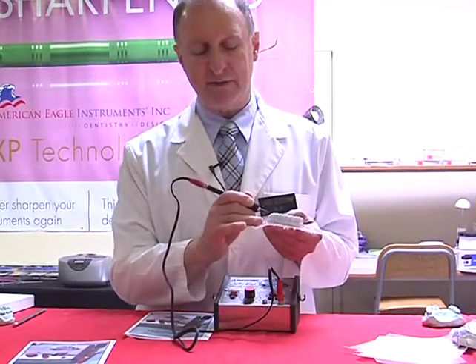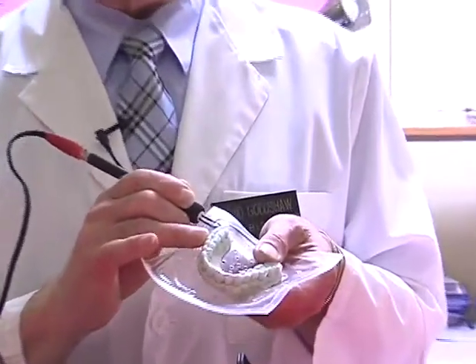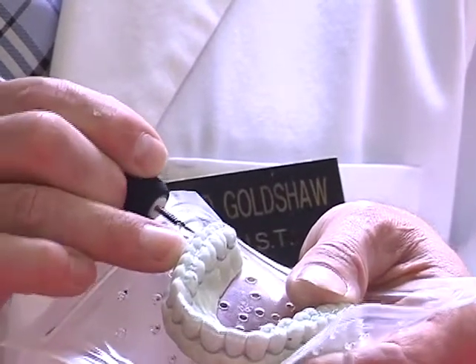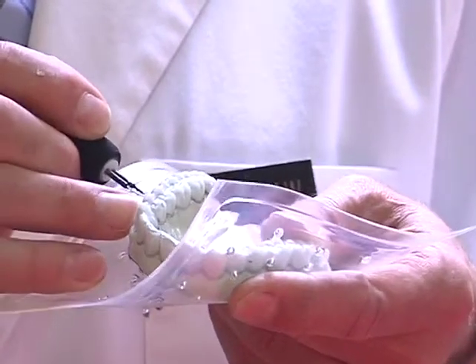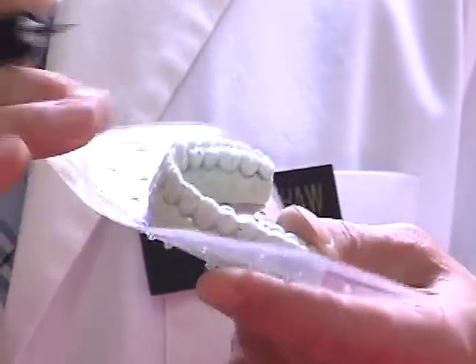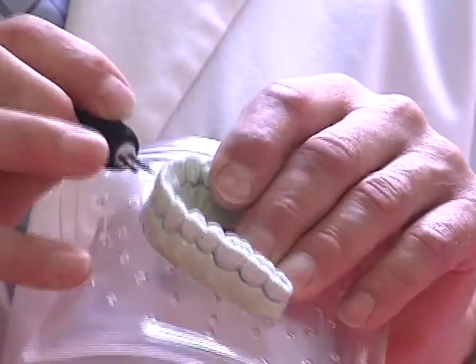I normally start posteriorly and work all the way around. As I start, I'm going to use a scalloping motion. This is the style of movement that I'll use, and I'll trim all the way down to the surface of the stone, with a light pressure, allowing the heat of the tip to penetrate through our thermoforming material as I scallop my way around.